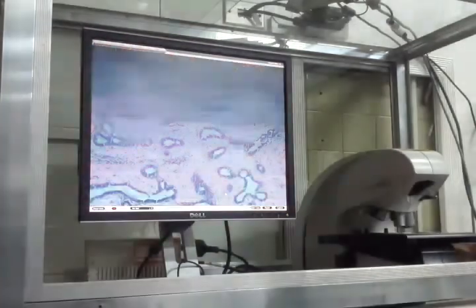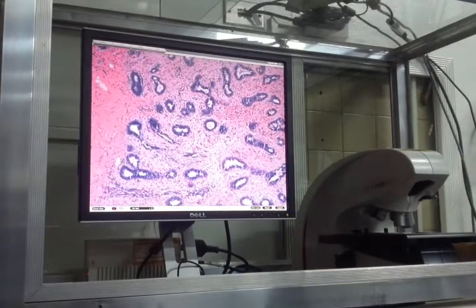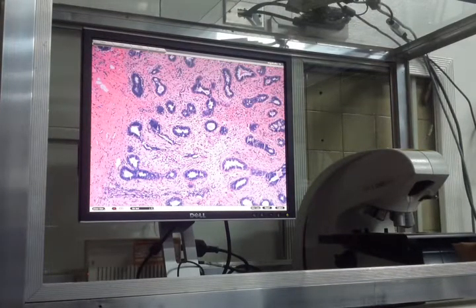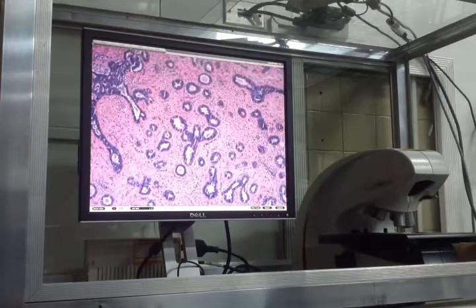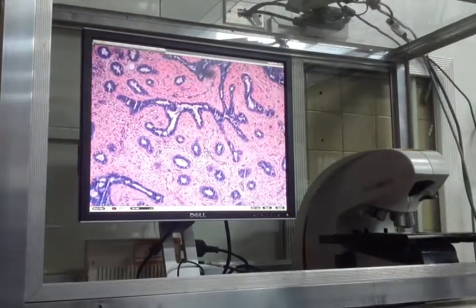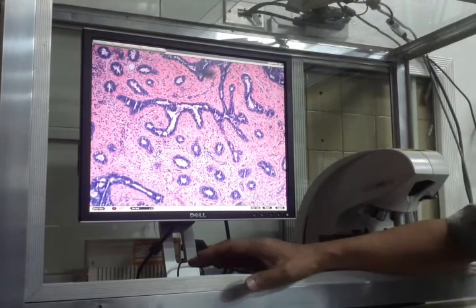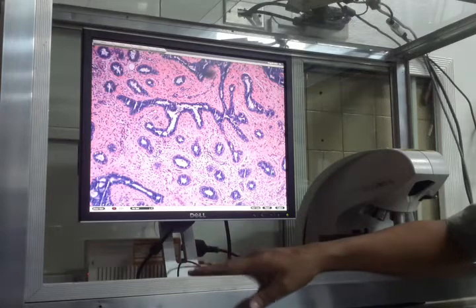Okay. The problem is it is very much proliferating, and the stroma is highly fibrous. Okay? Here you have myxoid degeneration in some areas. You have these ductules proliferating against a fibrous stroma. You are in neoplasia. How will you term this? What is the nomenclature? Glandular structures, benign. Adenoma. Okay? Fibrous tissue, adeno. Fibroadenoma.